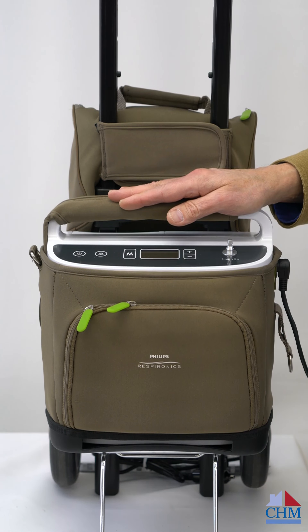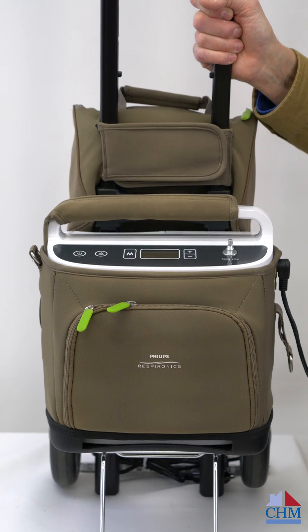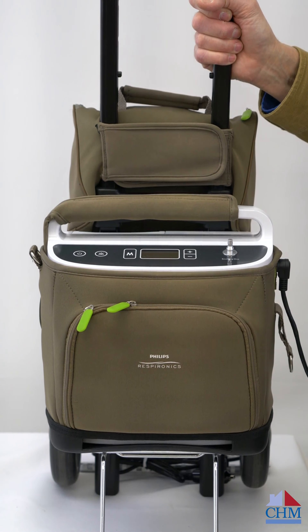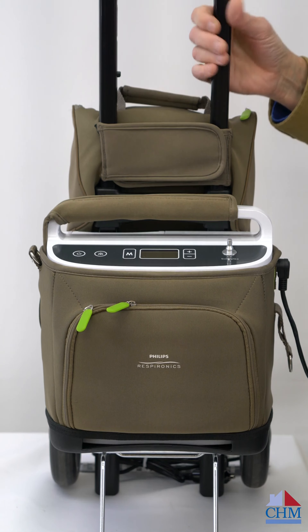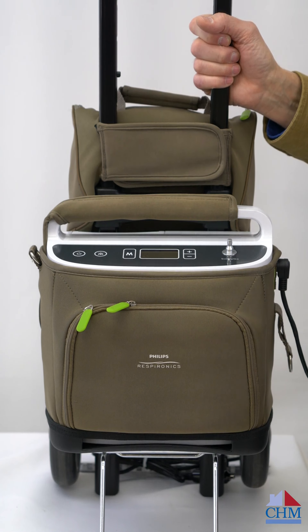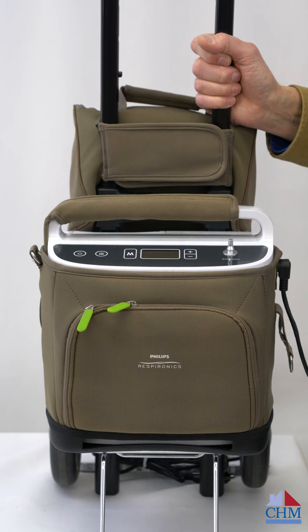The Simply Go we've got here is in a two-wheel cart. With all of our units that are in a two-wheel cart like this, it means the unit is big enough to make continuous flow and pulse flow. It has a mode selector on it, so we can switch back and forth from continuous to pulsing flow. The smaller units can only be used in the pulsing mode.